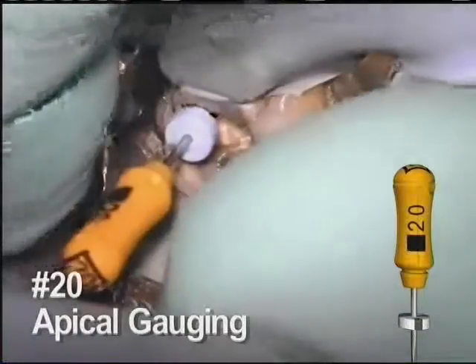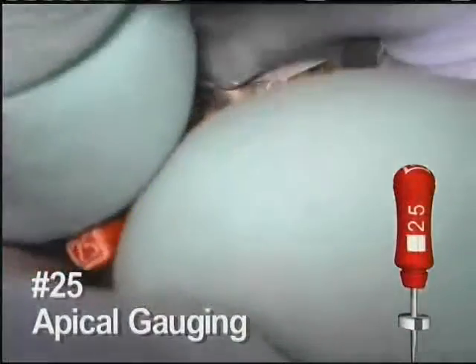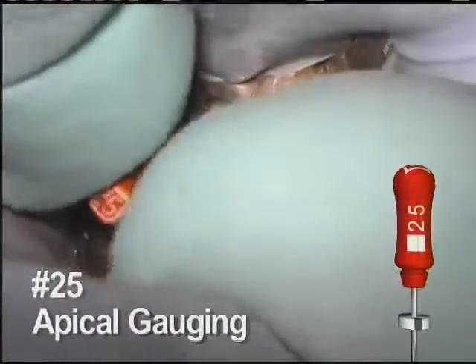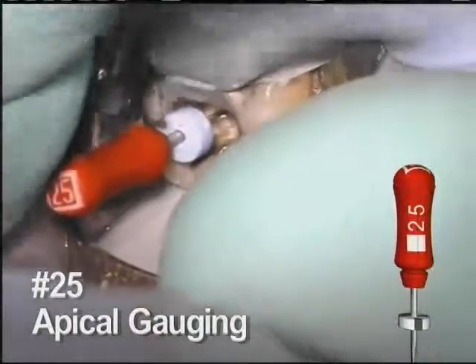In this canal, the 20 hand file fits appropriately. Although we're happy with the fit of the 20, for this example we tried the 25 hand file. It is also gently worked into the canal space. In this specific canal, it is too large and does not quite reach length.